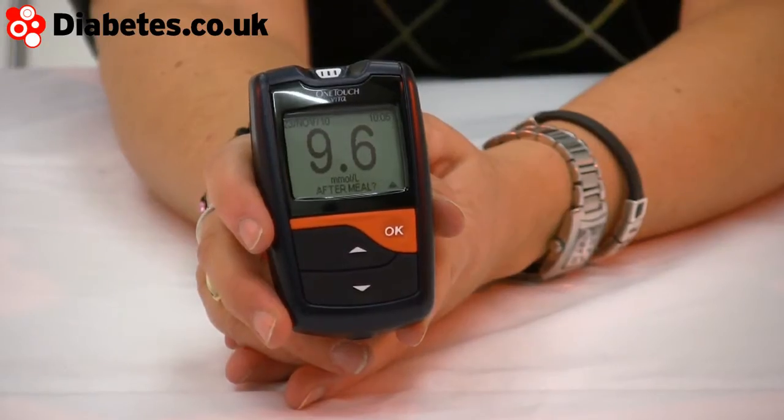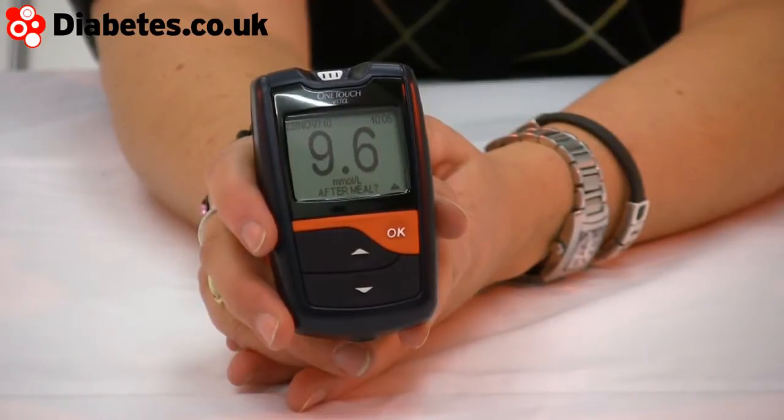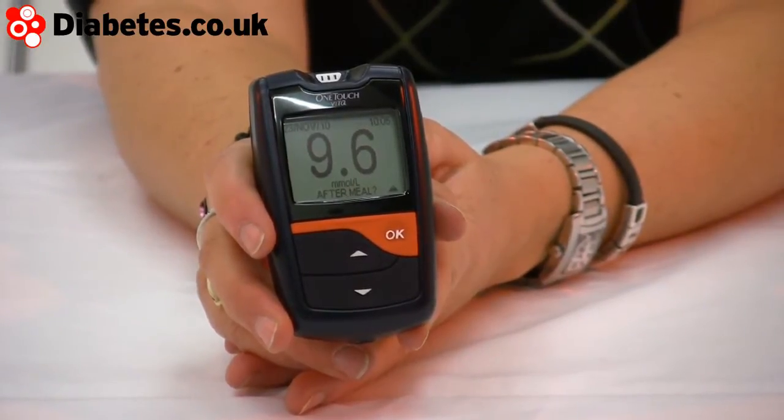This meter is the OneTouch Vita. OneTouch is the collective name of the meters from LifeScan. There are a few to choose from and one of them will suit you better than the others, so just have a think about which one you might prefer.